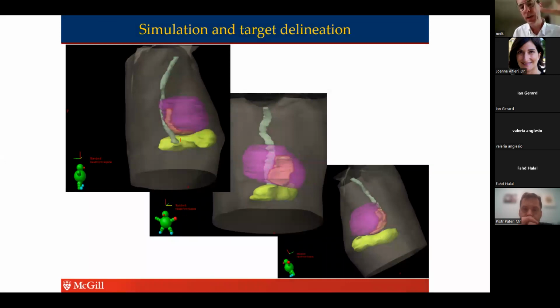Another view, and you can imagine all of us sitting around the table, meaning the radiation oncologist, medical physics, but also our cardiology colleagues, to manipulate and turn these contours in 3D, sort of playing with it virtually, if you will, to get a sense of whether or not we've got a sensible volume that corroborates well with the voltage mapping that we did previously.